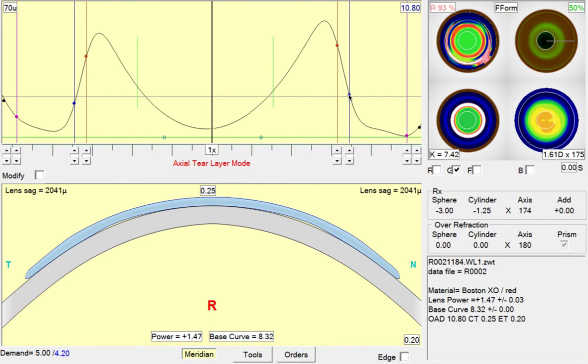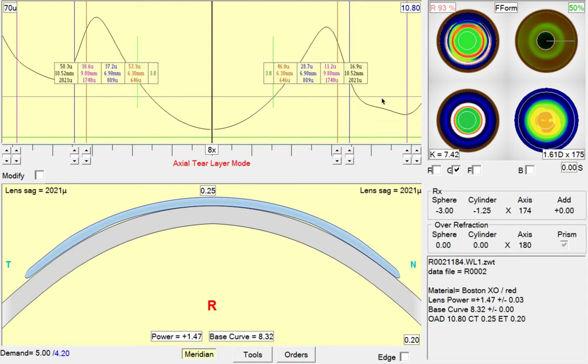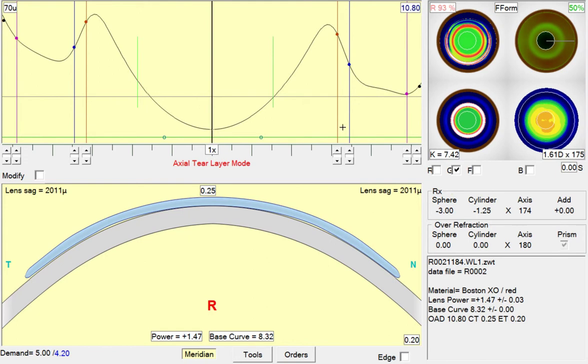What I would try is decreasing this by 20 microns. So we'll go for a target of 803. We're going to click up a couple times. That's probably a little too much. Come back down.